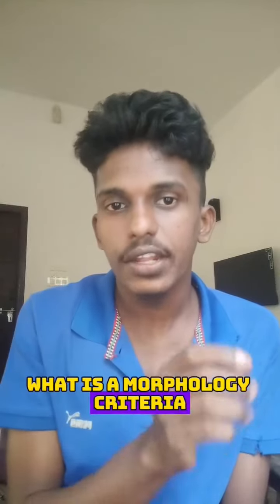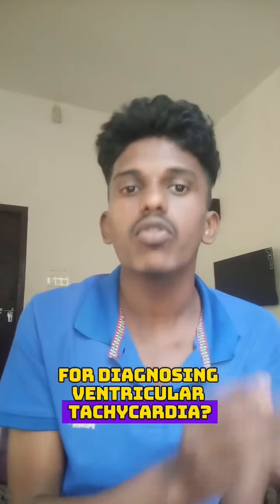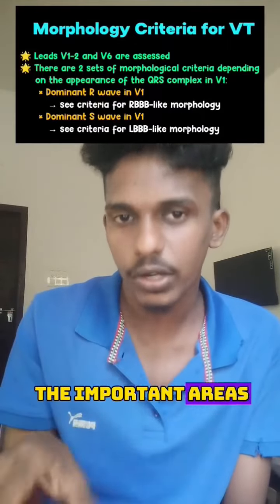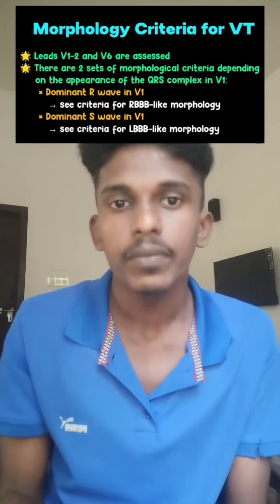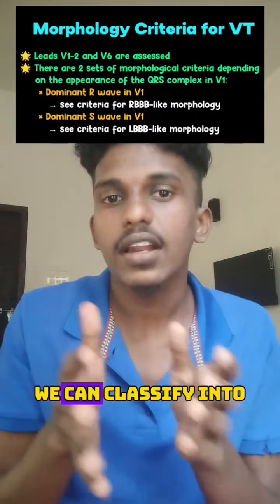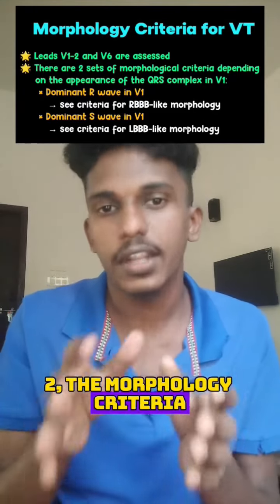What is the morphology criteria for diagnosing ventricular tachycardia? For morphology criteria, you have to look into V1, V2 and V6. These are the important areas, V1, V2 and V6. Then based on the appearance of the QRS complex in V1, we can classify into two. The morphology criteria has two sets.